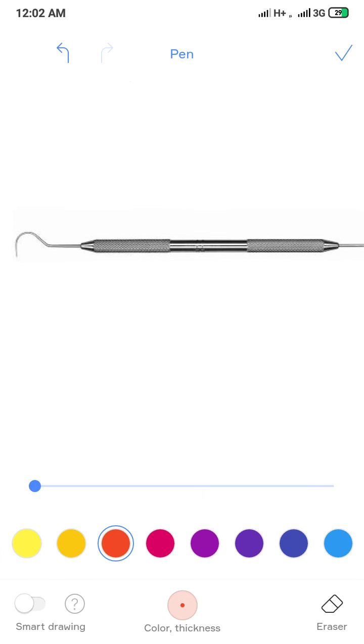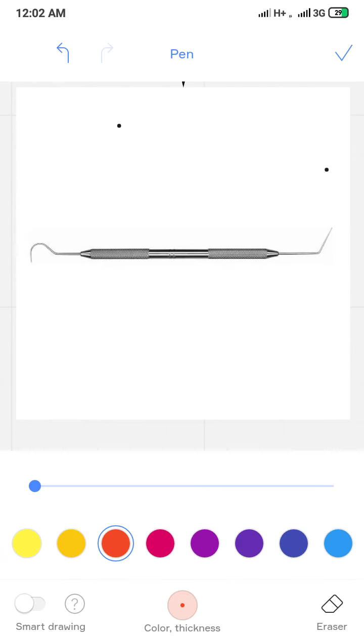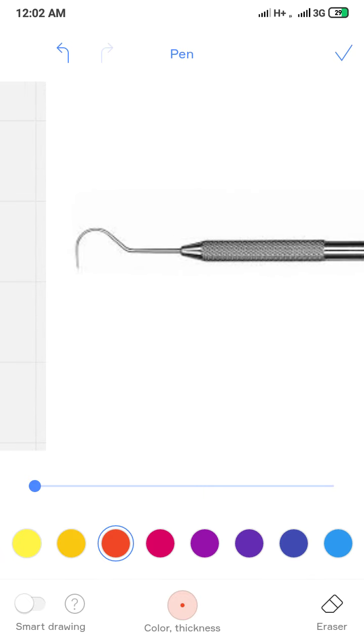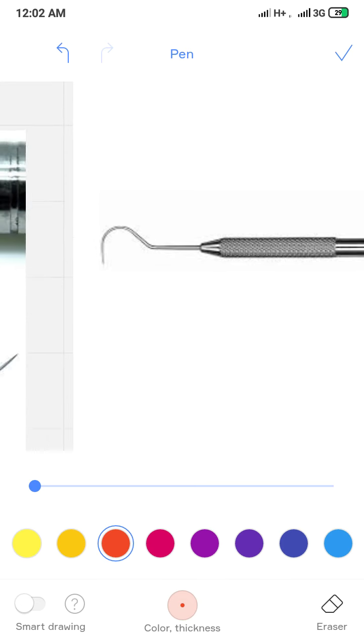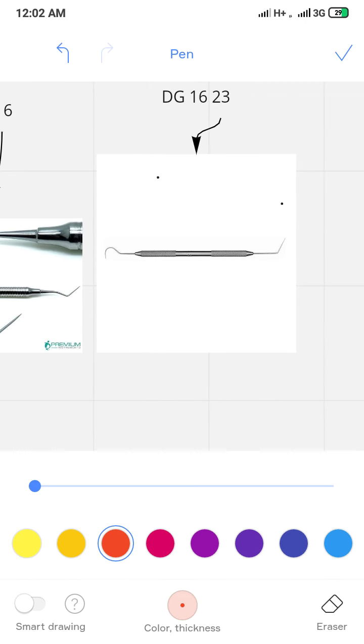But if you notice, this instrument looks very similar to our standard Caries probe, and that is interesting because you can actually use the standard Caries probe as an explorer. All you have to do is just bend this end with a tweezer so that the angulation becomes more than 90 degrees, and you can easily explore the mesial and distal canals with it.